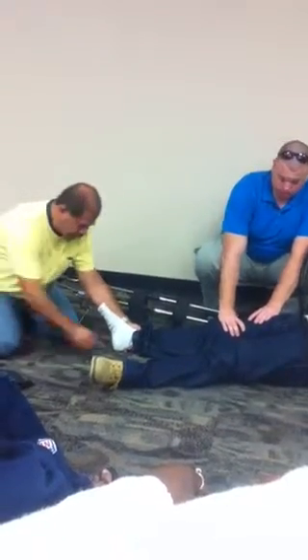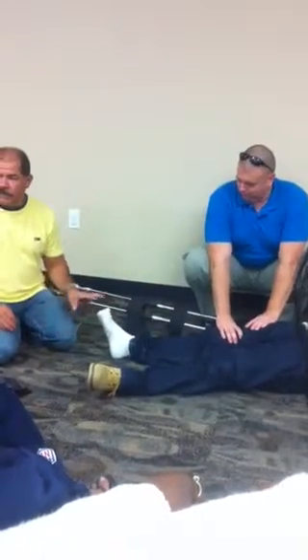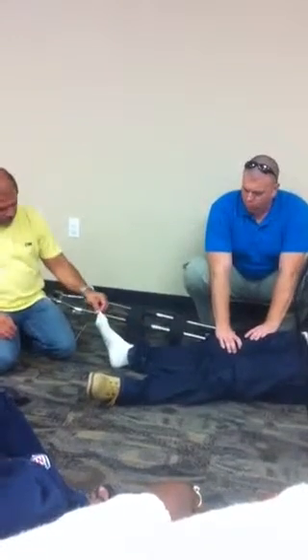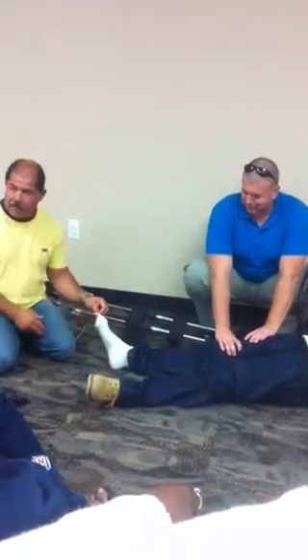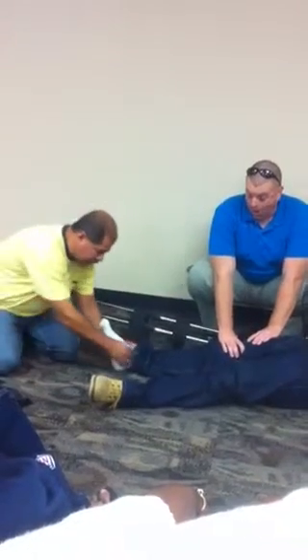Okay. Now, if you have to cut off a sock, if he's got long socks, probably the best way to do it is pull this up, clip that, make a hole, and then just run your scissors down the side. That's a pretty easy way to do that.